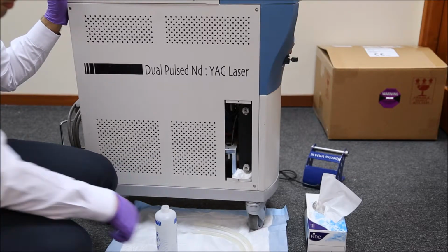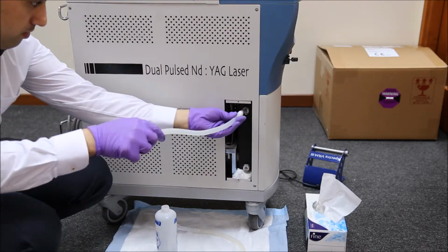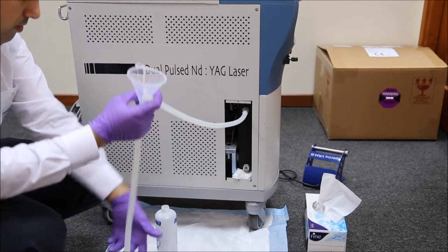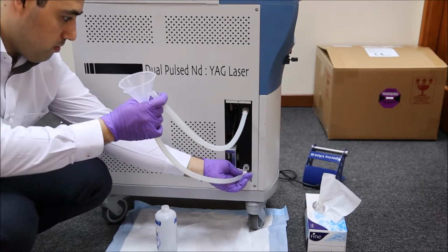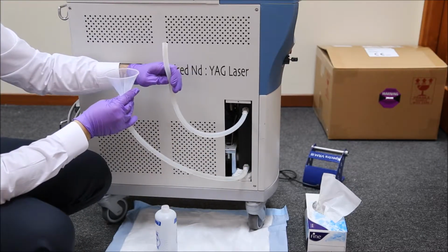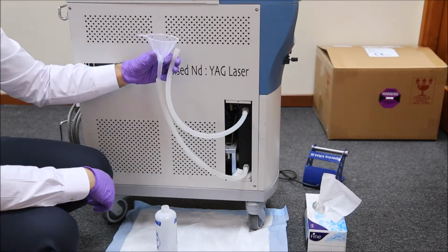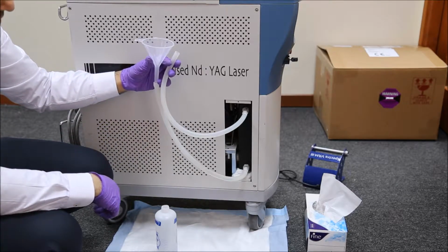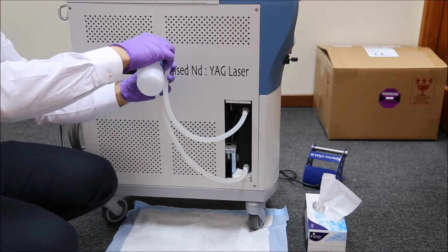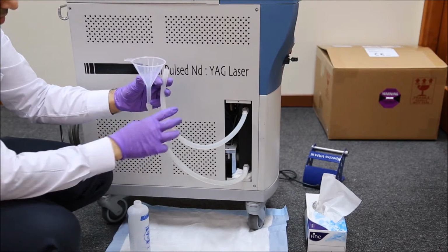5. Insert the extra tube provided with the funnel into the upper inlet and then insert the connector of the funnel into the lower inlet. 6. Hold up the funnel and pour the distilled water into the funnel. At this time, while the distilled water flows into the tank, the air inside the tank comes out through the upper tube. If the distilled water doesn't flow smoothly into the tank, hold up the funnel higher.